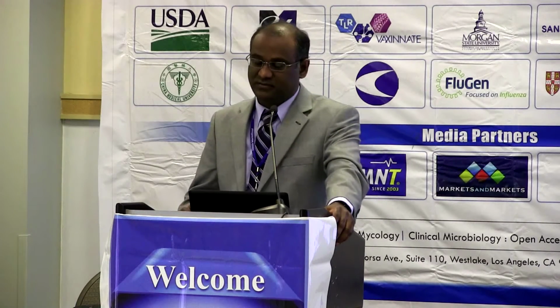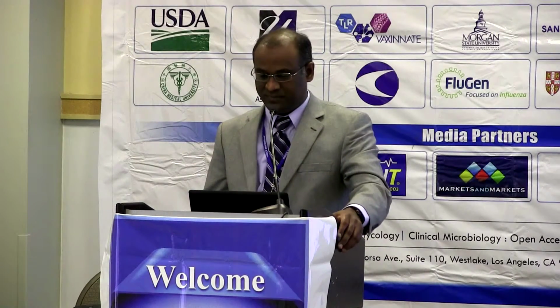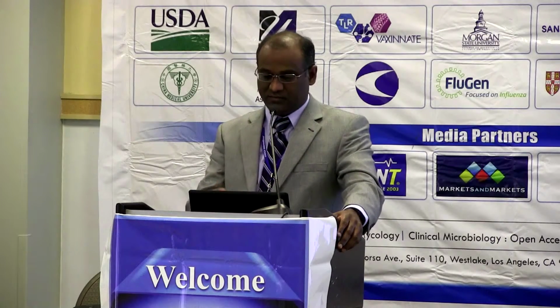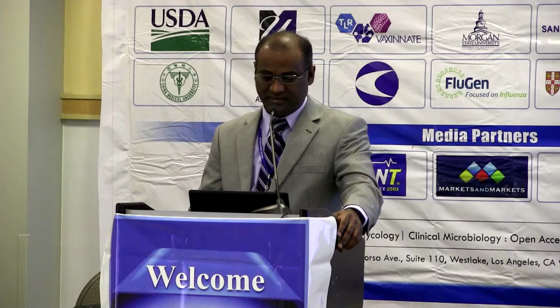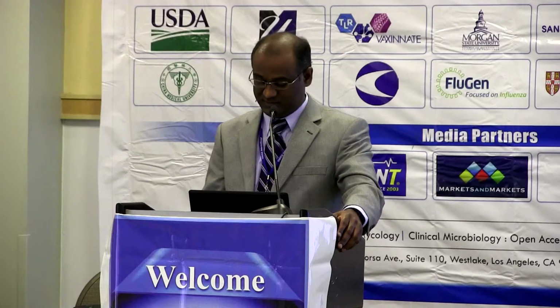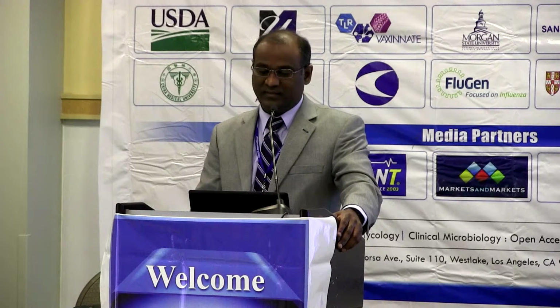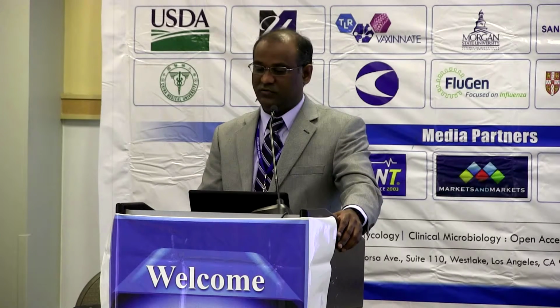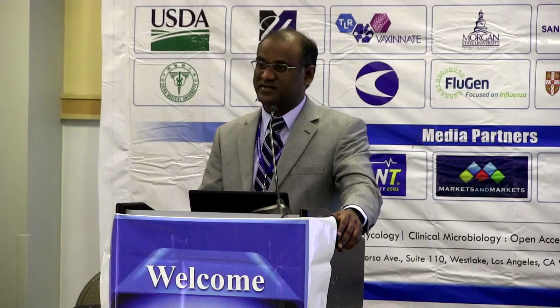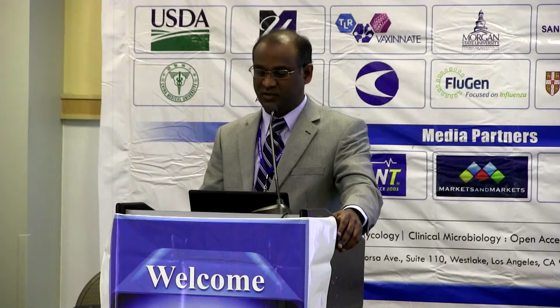a history about the rapid influenza diagnostic test. It was approved as early as 1998, and there were about 18 tests available. For the most part, they had good performance criteria, about 73% sensitivity for flu A and 60% for flu B. But if you look at the same kit from manufacturer 1, their package insert states 79% sensitivity, lower bound of confidence interval 75, higher bound 83, and all the subsequent clinical studies done after the marketing of those tests, you could see all these yellow marked studies, basically did not perform to their package insert.